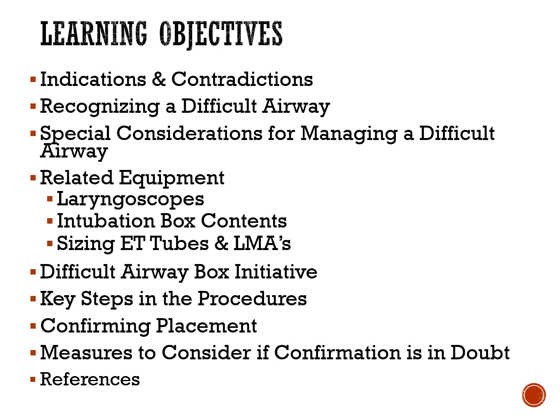We'll then be focusing on confirming placement. As you can imagine, extremely important to confirm proper placement. If you're in doubt, follow the protocol for removing the tube, deflating the cuff, removing the tube, and resuming oxygenation and ventilation through perhaps a bag valve mask. And we'll be talking again along the lines of confirming placement, measures to consider if confirmation is in doubt.